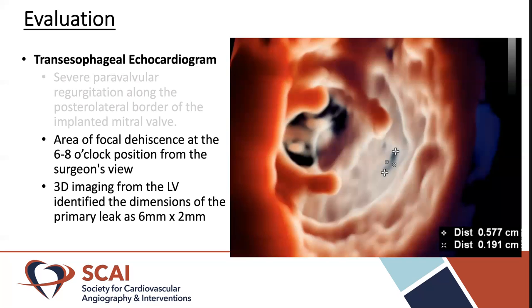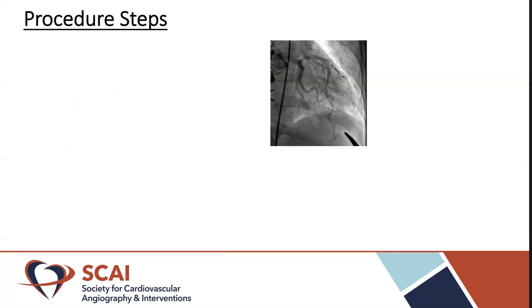And we've identified the location being at the 6 to 8 o'clock position from the surgeon's view. In this view, we're actually looking up at the mitral valve from the left ventricle, and we'll explain a little bit more about the surgeon's view later on.